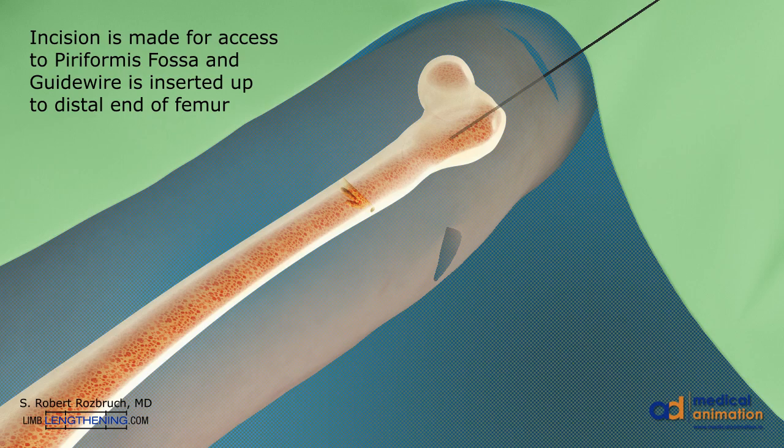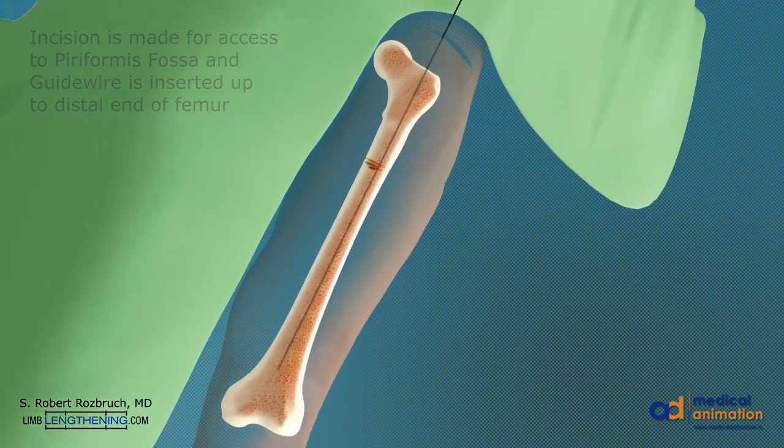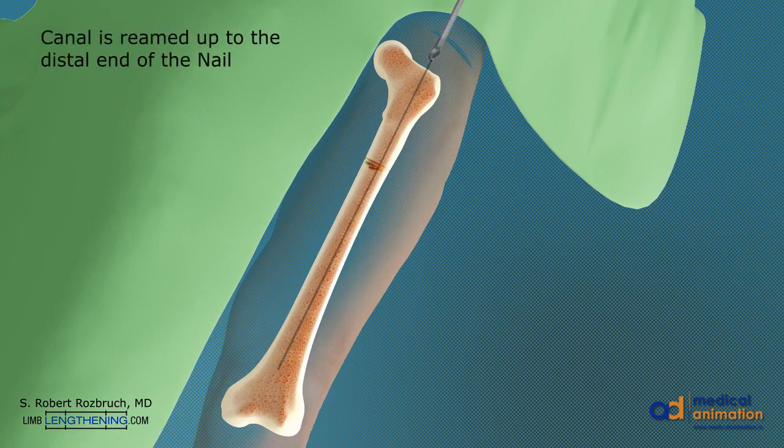A guide wire is inserted into the medullary canal until the distal end of the femur. The canal is then prepared with a flexible reamer up to the distal end of the nail.